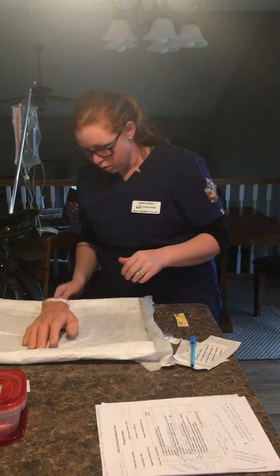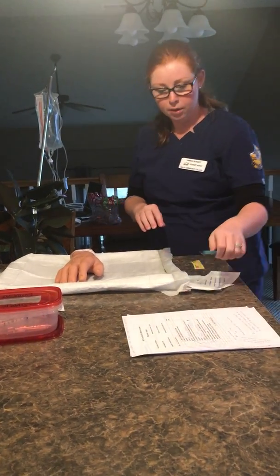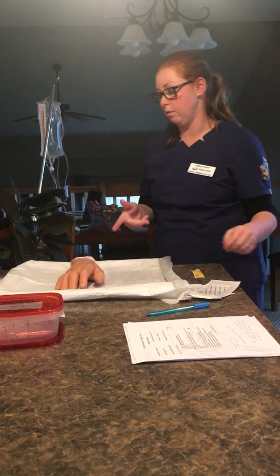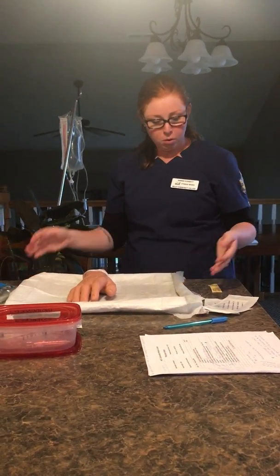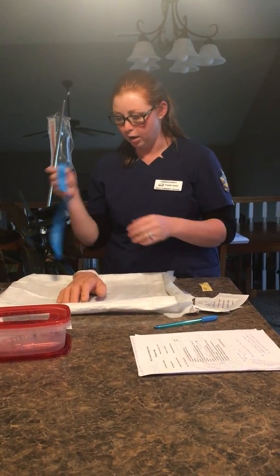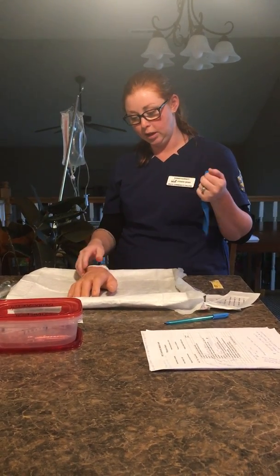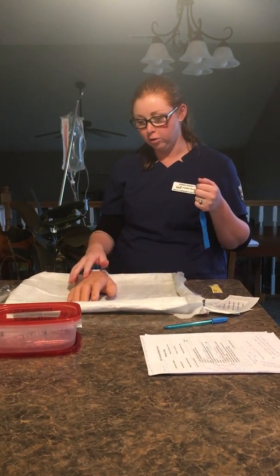Okay, so we're going to go back to our patient and again make sure they're the right patient and they're identified, and then we're going to go ahead and place the IV catheter. So I'm going to wash my hands really good. I also did that right after I walked into the room the first time before I started messing with things. So I'm going to wash my hands again, and I'm going to go ahead and approach my patient, go ahead and look at their, in this case it's her hand. See if I can identify a good vein.